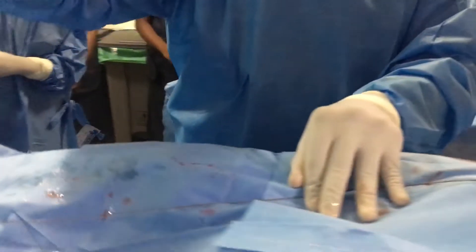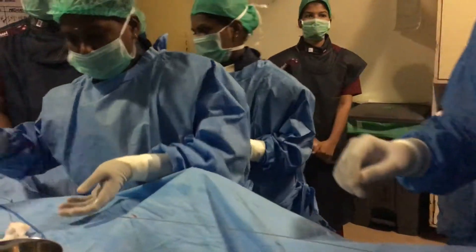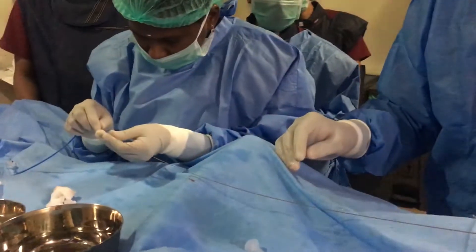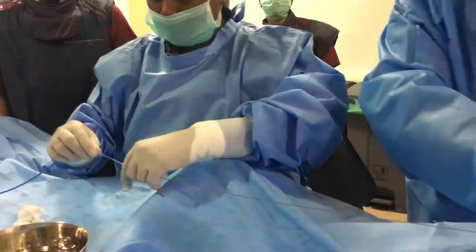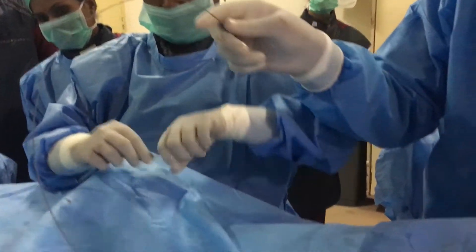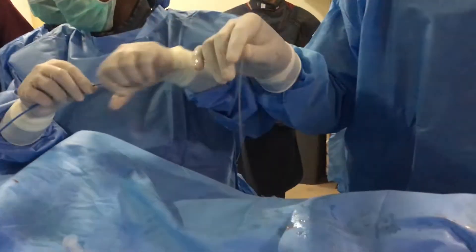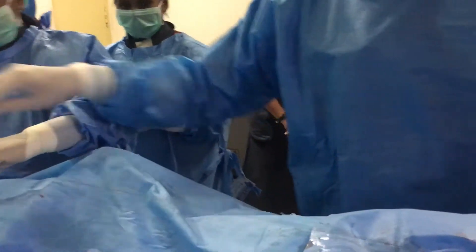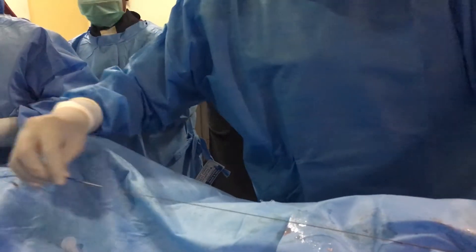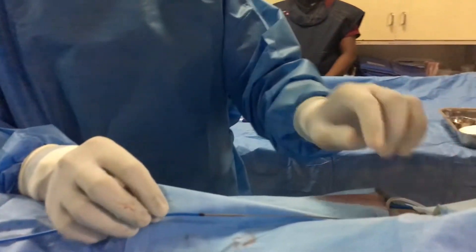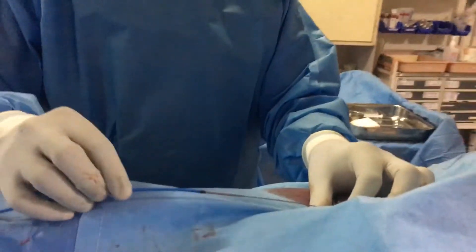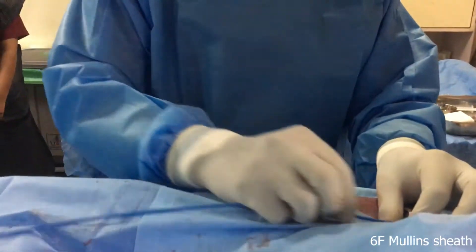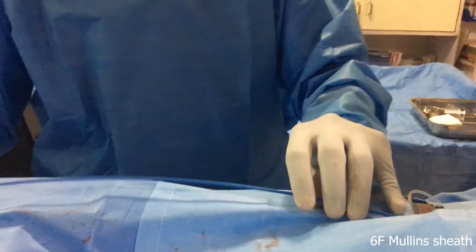Put the Mullein sheath this way. Yeah, keep it straight. Fix it. I'm just taking the Mullein sheath. So it's an 8 French sheath here, femoral sheath. So this will easily go inside the bigger sheath and it will be easily negotiating into it.